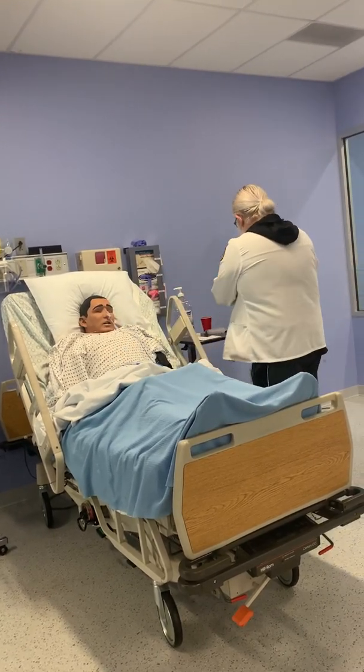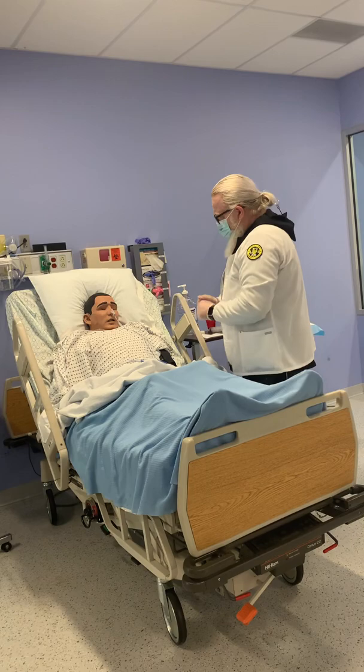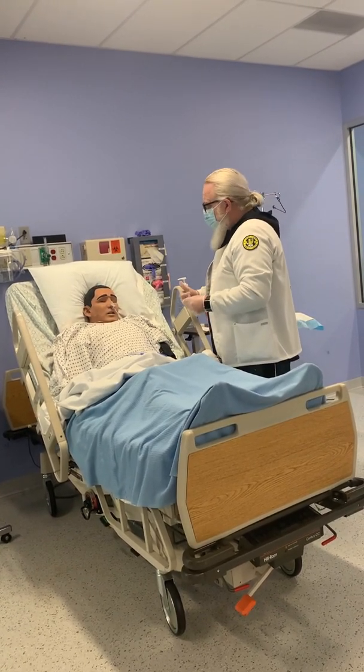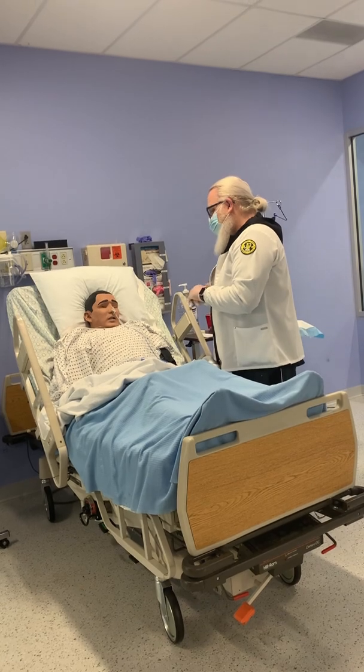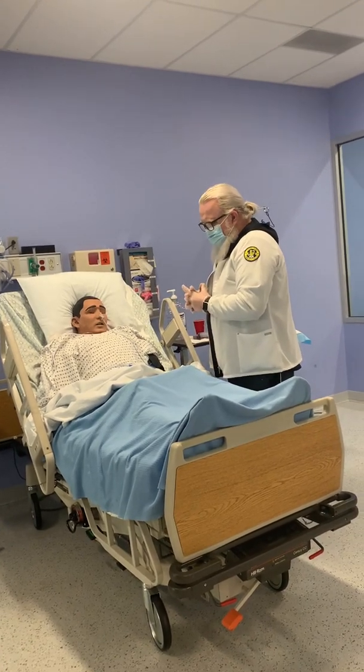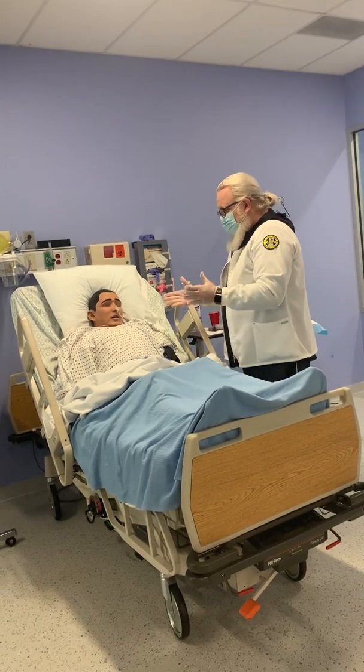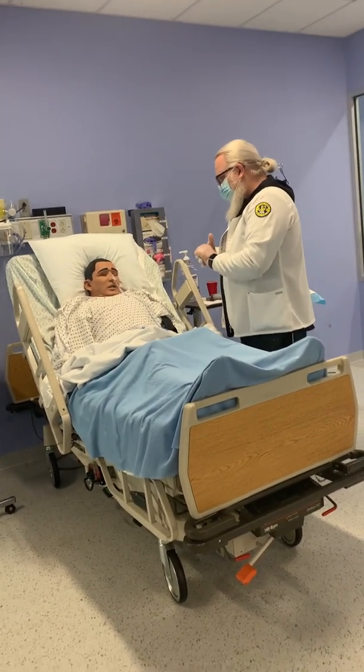Move this out of the way. Make sure you're comfortable. I'm gonna wash my hands, document the procedure that I was in the left nostril. Patient tolerated it well, and ask the doctor for an x-ray to confirm. That concludes. If you have any questions for me, please let me know. Thank you.